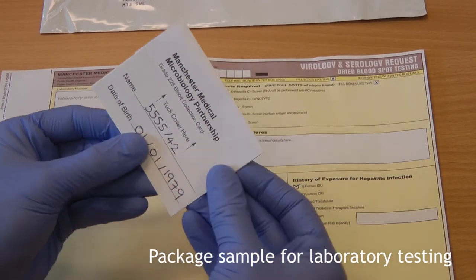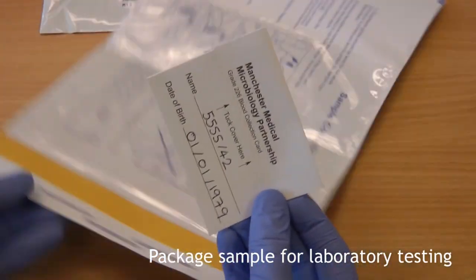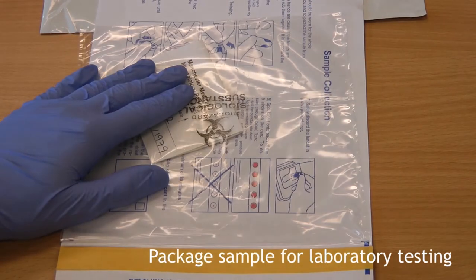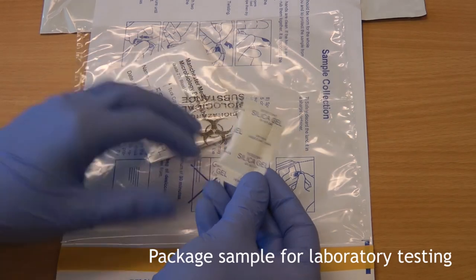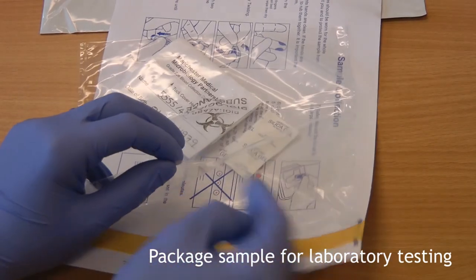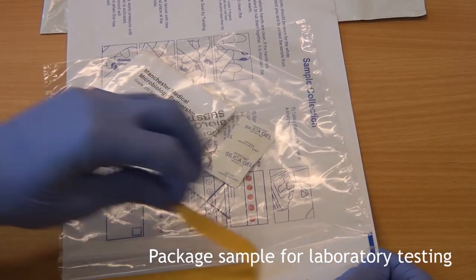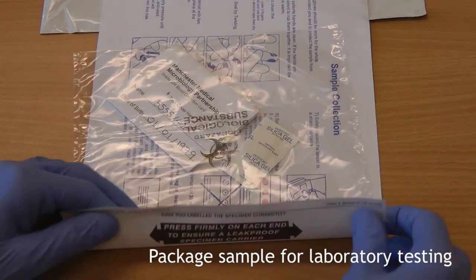After the card has been drying for 30 minutes, close it and put it and the silica gel packet into the clear plastic bag attached to the request form. Please ensure the silica gel pack is included, as this helps preserve the sample during transport. Once you have checked the correct details are on the request form and the card, remove the brown tape and seal the card into the plastic bag.